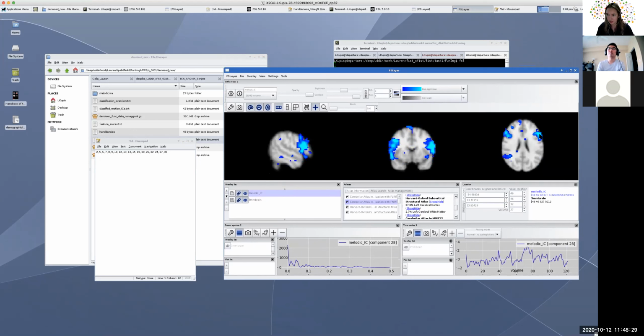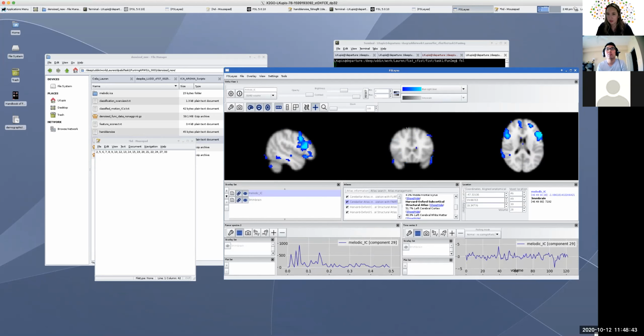It's really cortex, and this looks fine. It's mainly in the lower power spectrum region, so that's good. So I'd keep this one in, number 28. And then let's see.